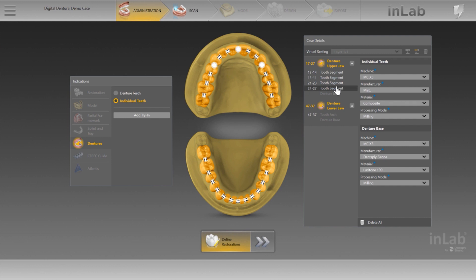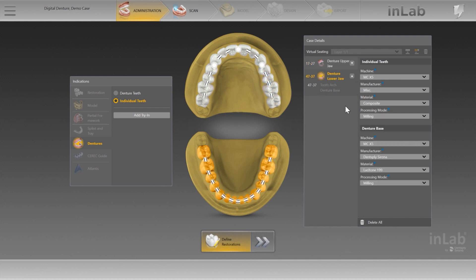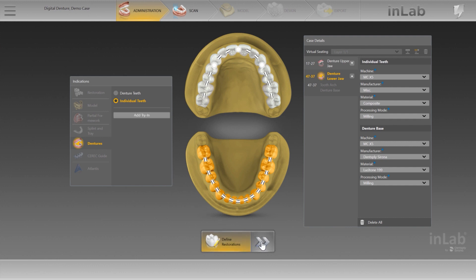As soon as the tooth arch is separated by removing connectors, the resulting arch segments are listed as individual elements in the case details. You can change the material here once again. If needed, you can add a monolithic try-in for the case. In the case details, specify once again the machine, manufacturer, and processing mode for the try-in.